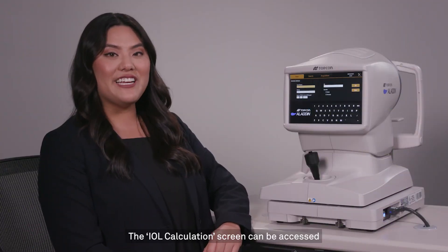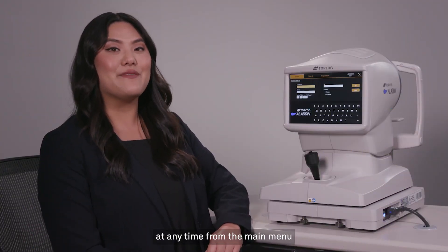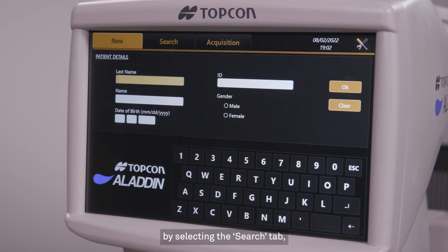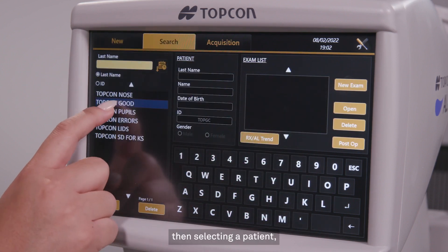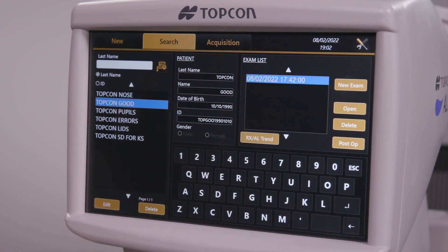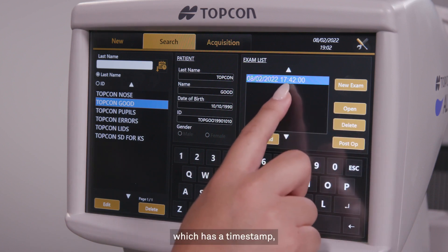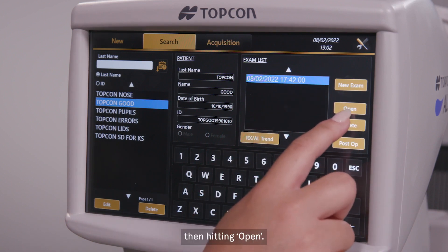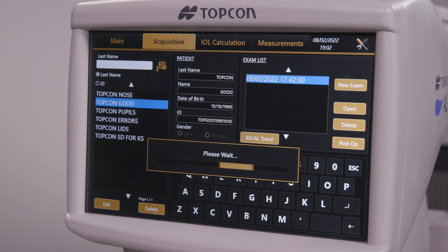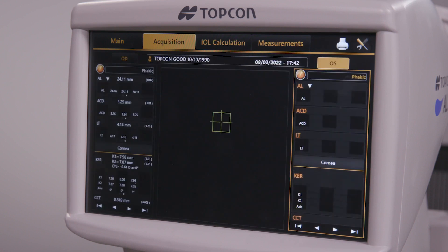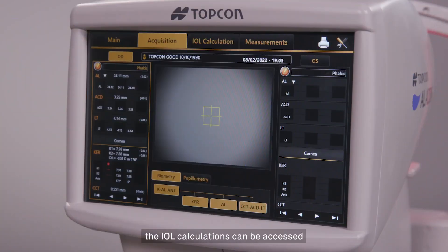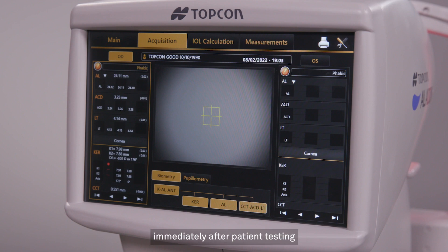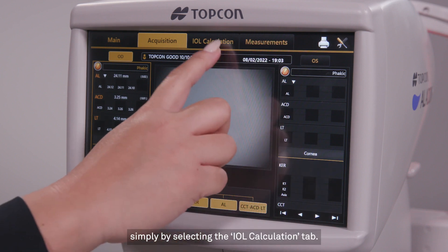The IOL calculation screen can be accessed at any time from the main menu by selecting the search tab, then selecting a patient, then selecting the exam which has a time stamp, then hitting open. Alternatively, the IOL calculations can be accessed immediately after patient testing simply by selecting the IOL calculation tab.